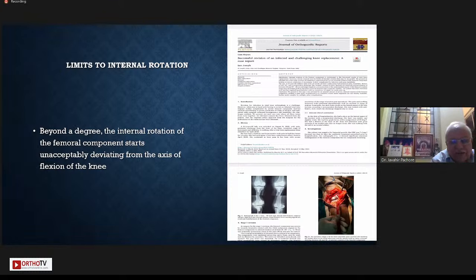The other part is, you blamed navigation, garbage in and garbage out. So again, you are doing the same thing in robotic. Those who are without CT scan are again likely to have garbage in, garbage out, because the posterior medial epicondyle is going to be problematic. And 1 degree here and there is going to make a tremendous difference if you do not use the CT scan. So I think there is no question that this new technology we have to observe very carefully.